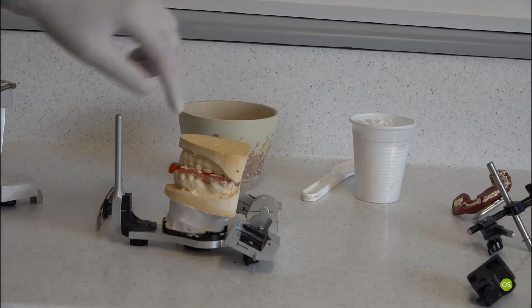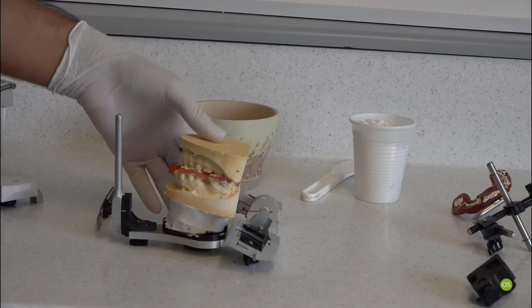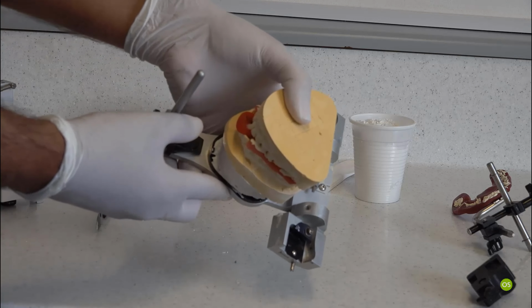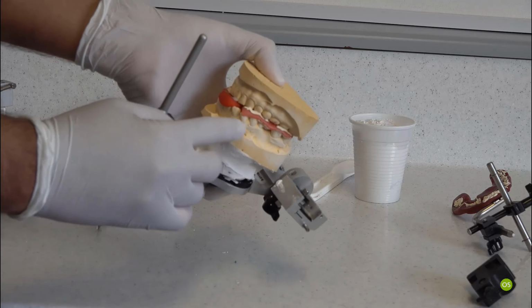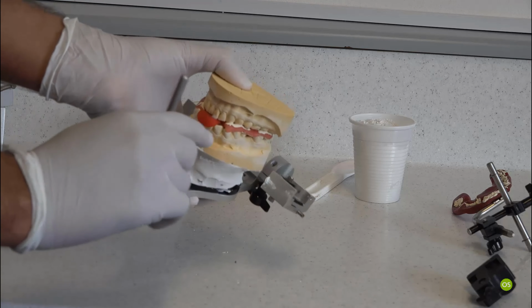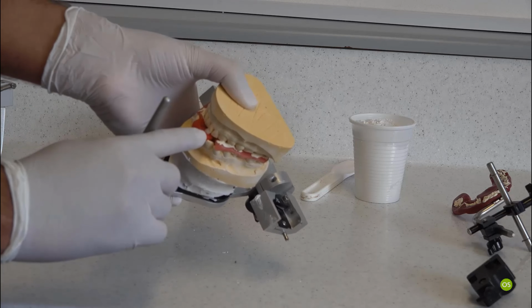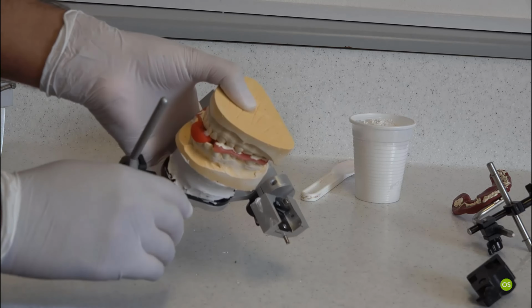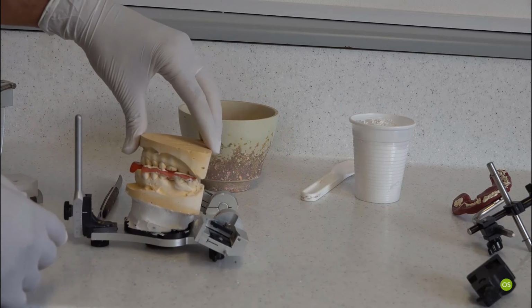And it's nicely aligned. It sits really well into the groove we made, and you can see here really well, it's seating really well all the way around. And more importantly, I can see that the incisor is locating on the light body flowable composite we placed really nicely. And there is no space, there is no movement. So I'm very happy with the way it's looking.